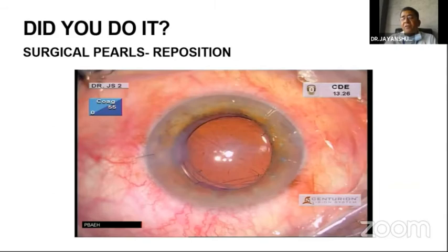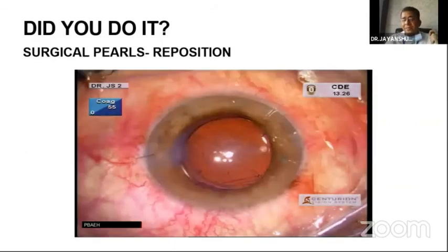So take it as two separate cases of detachment when you are handling it, because one bubble from the inferior side will probably unfurl the lowest arm of the V, and then you have another bubble from the upper side which is going to unfurl the upper part of the V. This type of detachment tear definitely requires a very good endothelial reserve once it is apposed to heal, because these corneas heal with the help of endothelial sliding.